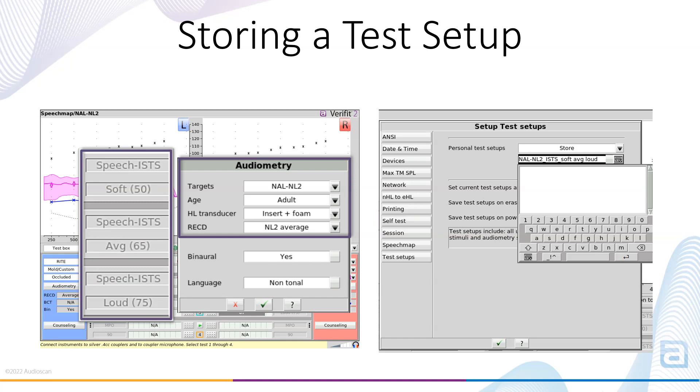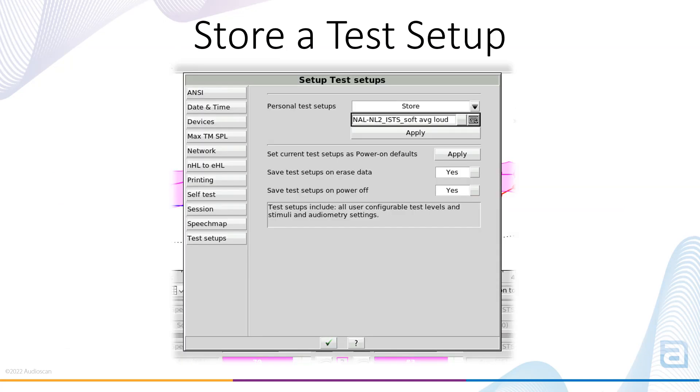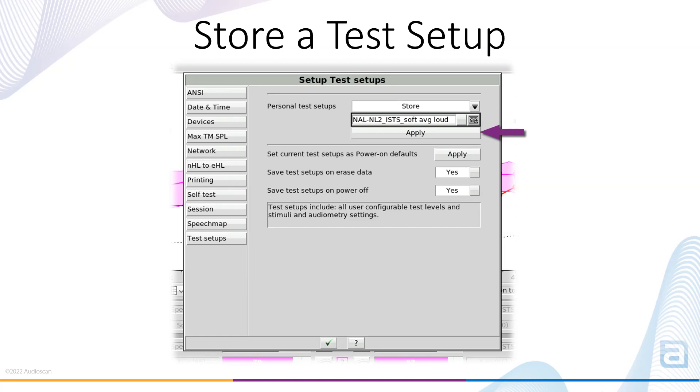If you are using Insertion Gain, the configured HL transducer, stimulus, and input levels are saved as part of the test setup. Next, choose Store in the Test Setup menu and give the Test Setup a name. This can be done via the virtual keyboard, via the keyboard you're using connected to remote console on your PC, or a USB connected keyboard to your Verifit 2 or Axiom. Once you have named the Test Setup, select Apply.